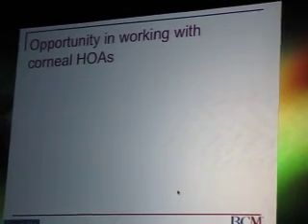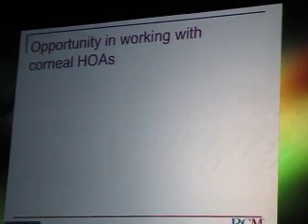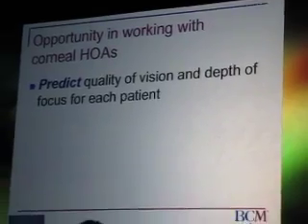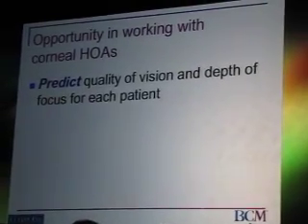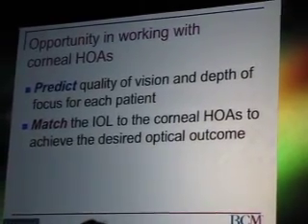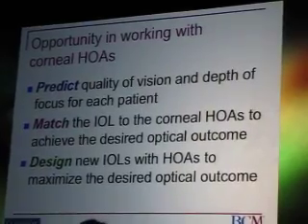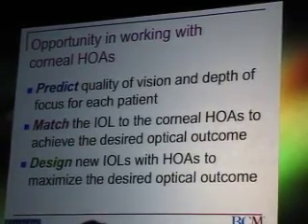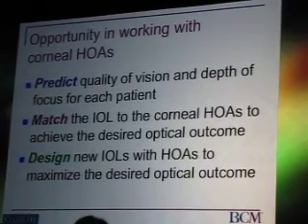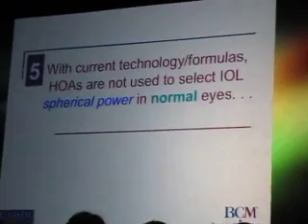Well, higher order aberrations of the cornea offer us an opportunity because if we understand them better and how they create depth of focus, we're going to be able to predict the quality of vision and the depth of focus for each of our patients. We're going to be able to match the IOL to the corneal higher order aberrations to achieve the desired optical outcome. And we're going to be able to design new IOLs that have higher order aberrations to maximize the desired optical outcome. And for example, I know that Graham Barrett is working on that very project now.